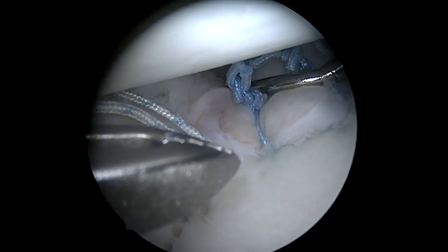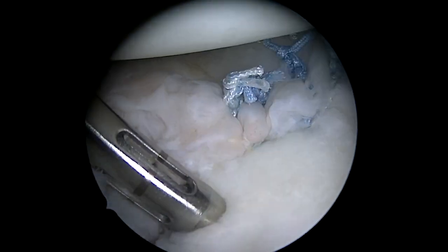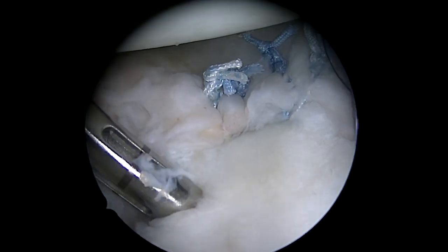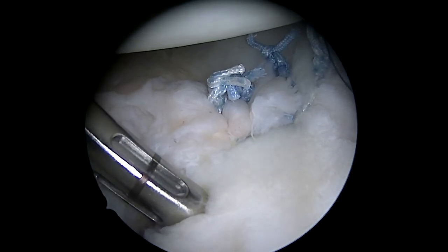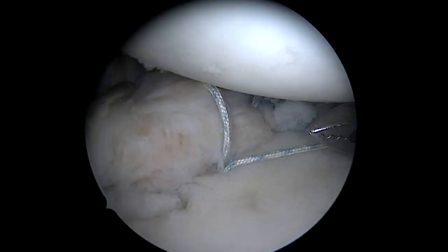You can see the piece is already higher than before. This particular piece is so large, though, that I really could not have placed sutures around it — with a smaller piece that would certainly be possible, but not with this one.